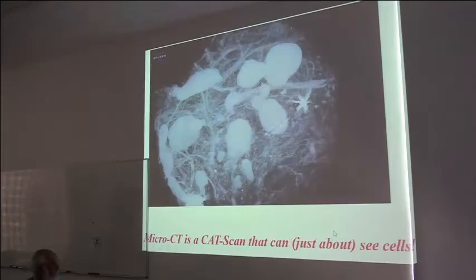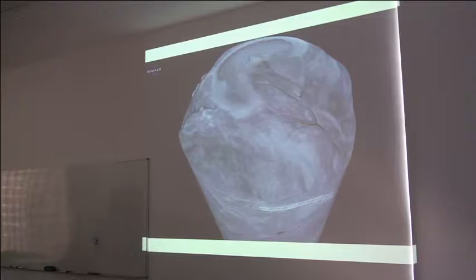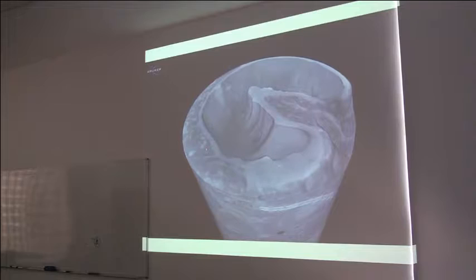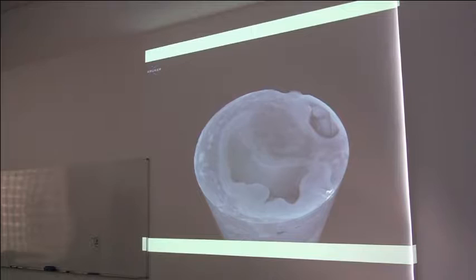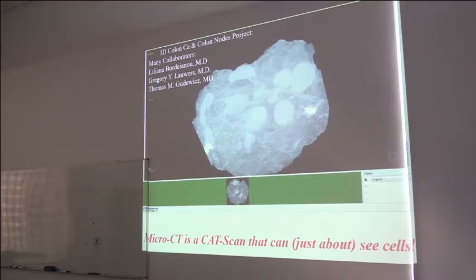Whoops, wrong slide. Finding lymph nodes in a colon cancer. This is a rectal cancer. It turns out that that cancer spreads first to the lymph nodes, and yet the pathologists have a lot of trouble finding those lymph nodes. It's a kind of a moronically simple problem. And here we can see this is the rectal cancer, that's the lumen of the rectum. And you're gonna see the little lymph nodes. Here's one here, here's one there, here's one there. And you're gonna see one appear in a minute, right there. And that one right there, bingo, is that cancer? Probably. So this gives colorectal pathologists a better way of finding the first place where cancer is likely to spread. Also has some useful applications for understanding this. So we have a group studying colorectals.